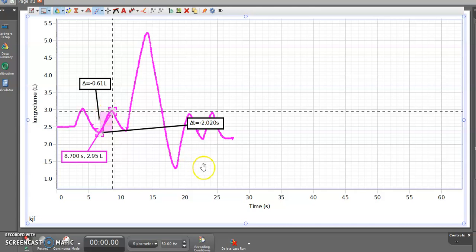The next one that you'll see on your sheet is the inspiratory capacity. That's as much as I can breathe in. Okay, it's important to remember that a lot of your lung volume you don't use on a normal basis. And even looking at taking a huge breath in and out, you really don't get a really accurate idea of your lung capacity, but we're going to try.